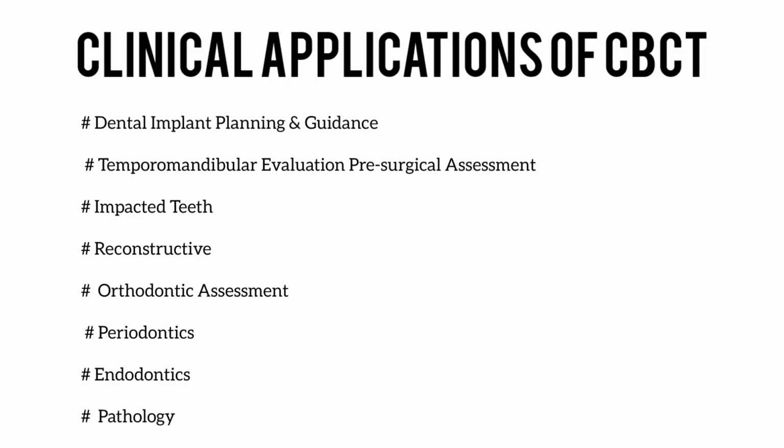Then the clinical applications of CBCT are dental implant planning and guidance, temporomandibular evaluation, pre-surgical assessment, impacted teeth, reconstructive, orthodontic assessment, periodontics, endodontics, and pathology.